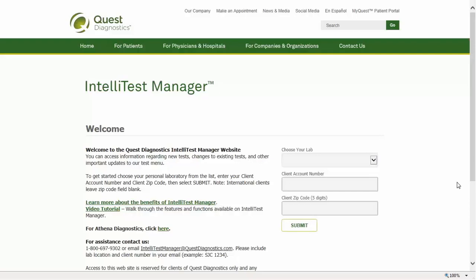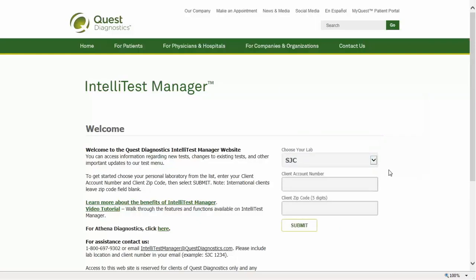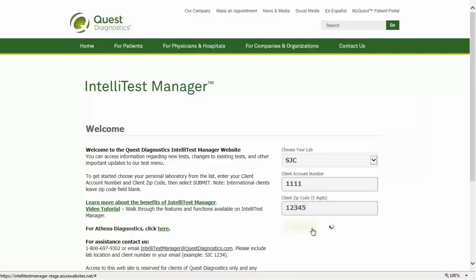To start, go to IntelliTestManager.com. Choose the laboratory location from the drop-down list for the test information associated with your account. Enter your client number and associated zip code, and click Submit. International clients leave the zip code field blank.